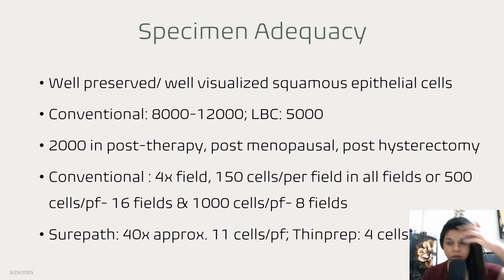Okay, well preserved means, as I said, if the conventional smear comes without fixative, you will get air drying artifact. That is not well preserved cells. Well preserved is a slide which has come in proper fixative, where the slide is placed into the fluid just as soon as the pap smear is taken. Not that it is allowed to be kept outside for a long time and then put into the fluid.